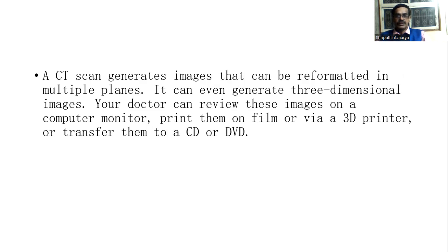It can even generate three-dimensional images. The doctor can review these images on a computer monitor, print them on film or via a 3D printer, or transfer them to a CD or DVD.